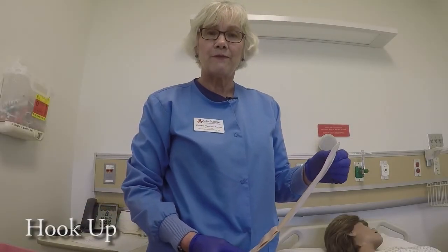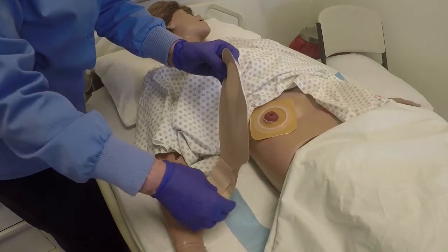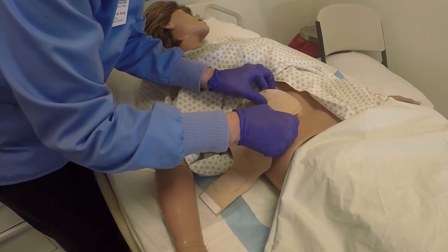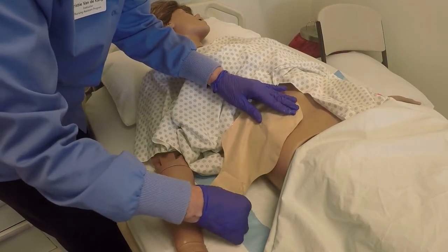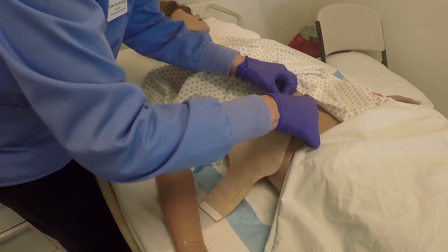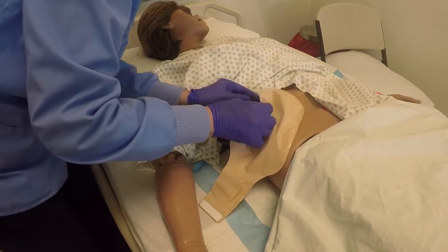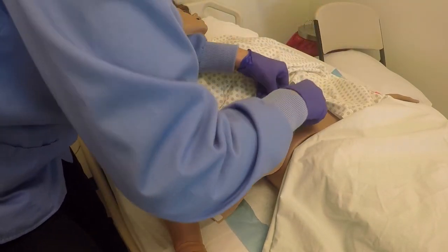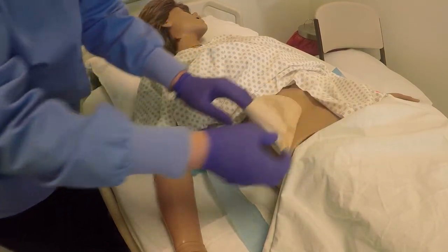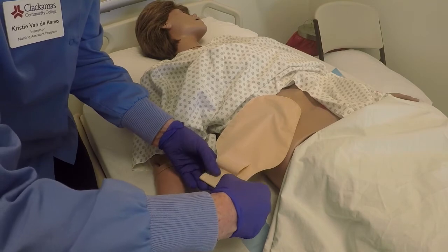H is for hookup. With a two-piece appliance such as this, I'm going to hook up the pouch to the skin barrier. I'll place the flange of the pouch over the flange of the skin barrier. The bag is at an angle for a person who's lying in bed, and the pouch will be emptied this way. Then I'm going to push down on it to make sure that it's snapped all the way around and has a secure fit. The last thing is to secure the bottom opening — this one has adhesive.